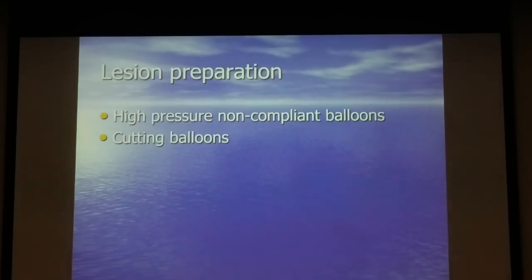The next level could be cutting balloons or scoring balloons. They have very limited availability in Jordan, so we don't usually address those a lot. But in some cases they need rotational atherectomy. And left main rotational atherectomy is extremely hazardous, extremely sensitive, because of no reflow. Patients can get hemodynamic compromise, go into hypotension and severe ischemia, so you have to be really fast and accurate in rotational atherectomy of unprotected left main disease. And we'll show you hopefully some examples.